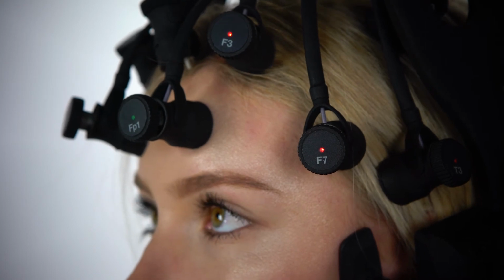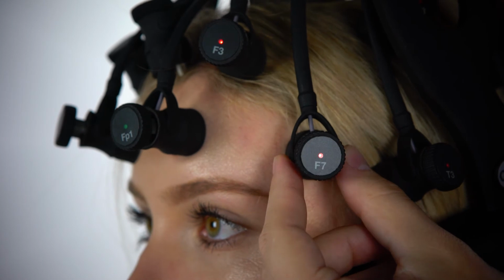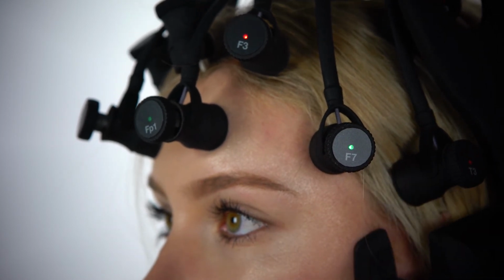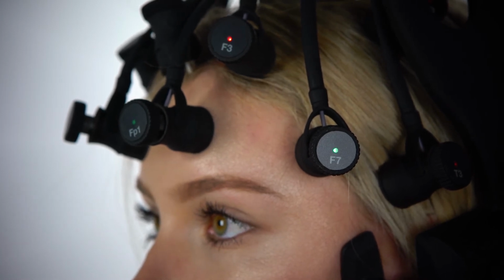Quick Series headsets feature full-time onboard impedance checking. LED lights on the pods remain red until the pods are properly positioned on the subject, at which point they will turn green, indicating acceptable impedance levels. If you need to adjust a pod, try these methods.